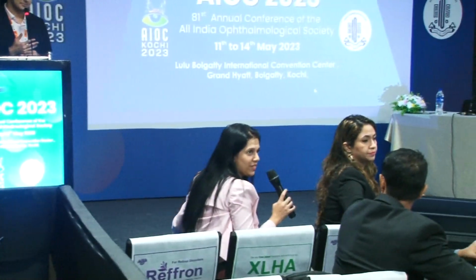However, I do use the IPCL in a lot of cases where the size or the range of power or the finances are an issue. I think it's not that one is better than the other. There are many studies that have shown good results, predictability, safety, stability. The entire power is going to be corrected with both. So it honestly comes down to each surgeon's preference in choosing which phakic IOL he's more comfortable with.